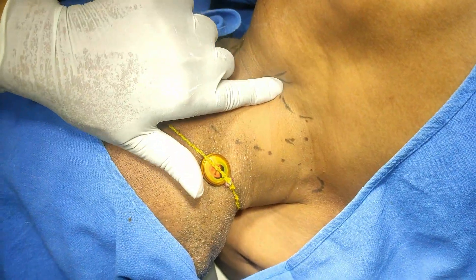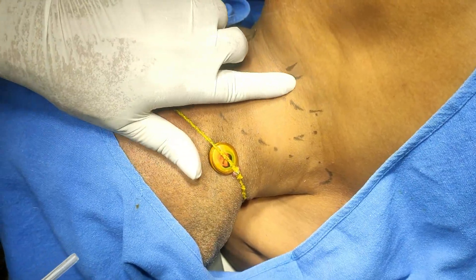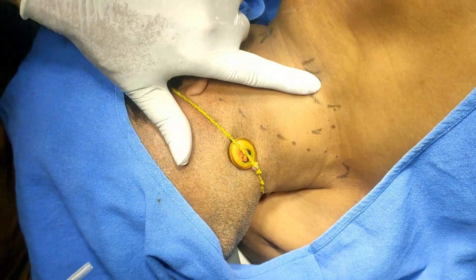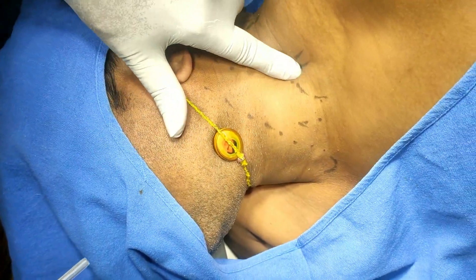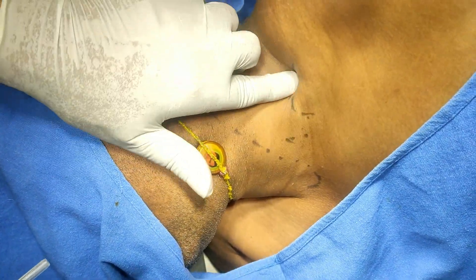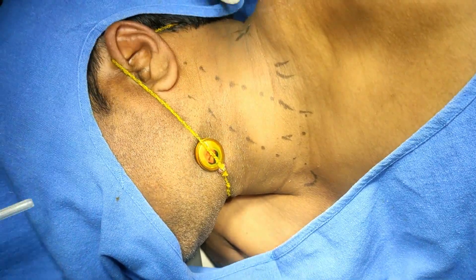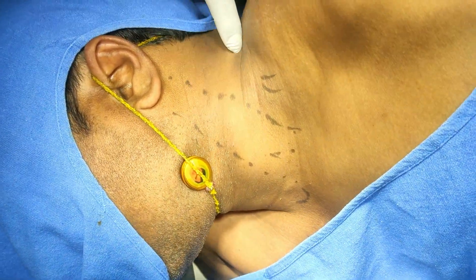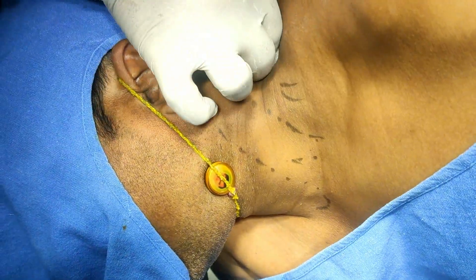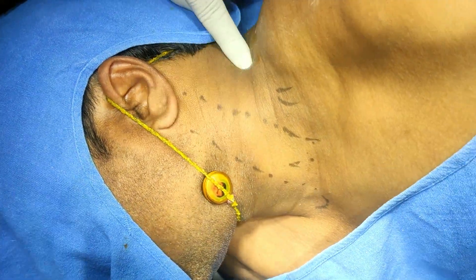Just lateral to the sternocleidomastoid, I can palpate it, and in between the two heads — the scalenus anticus and medius — there is a cleft. Just deep down you can feel the omohyoid. The cleft is in between these two. I have marked this is the levator scapulae and posteriorly is the trapezius. I have taken a point in between these two: the levator scapulae and trapezius.